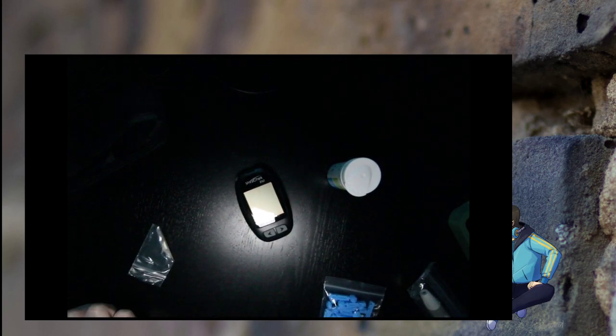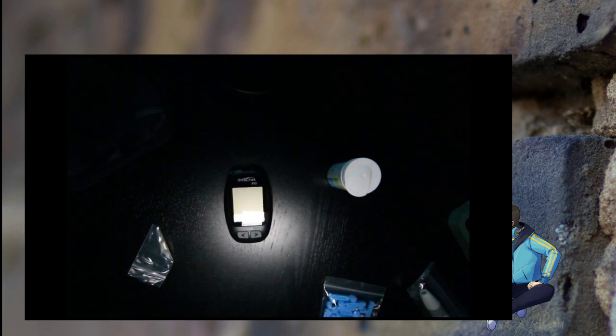Let me see whether my manual tells me what the L1, L2 was meant to be. There's hypoglycemia alarm. Oh, L1, L2 is like basic or advanced mode. So I'll choose advanced mode, it supports the before and after meals. How do I get back now? Because I actually want it in advanced mode.